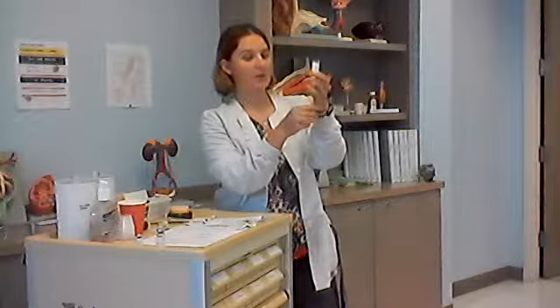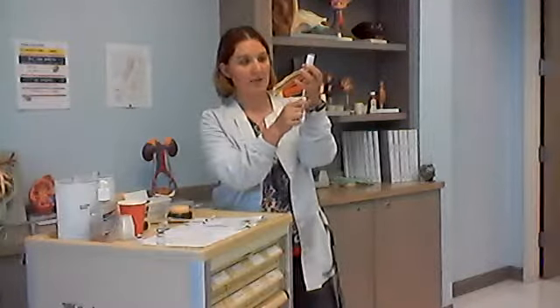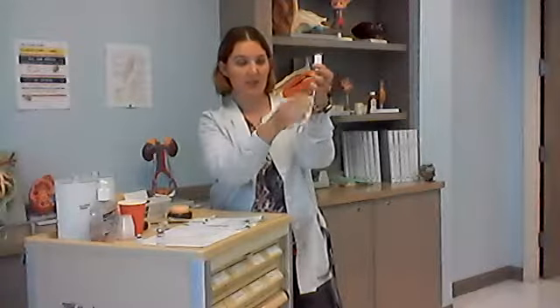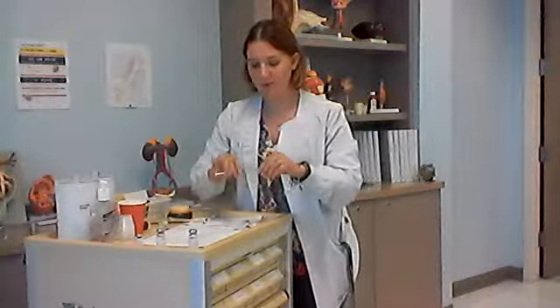Now you might get air bubbles. That's okay. There are some different tricks to get rid of air bubbles. You can flick it while holding it straight up and down like I'm doing and push the air out. You'll see some nurses draw past what they need. Make sure the air is at the top of the syringe, then inject the air out. You're going to have to play with it to figure out how to get the air out of the syringe. So I got my 0.5. I'm going to safely one-handed recap. Now it's a clean needle, so I can recap clean needles. Once it touches the patient, no recapping.